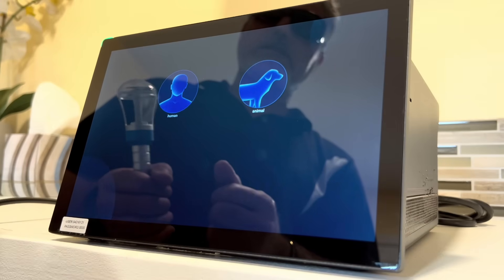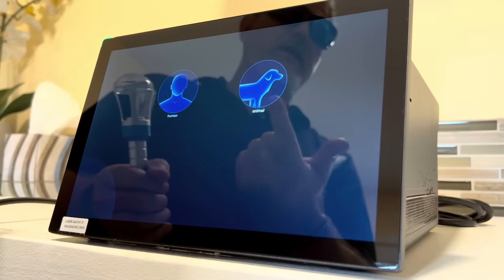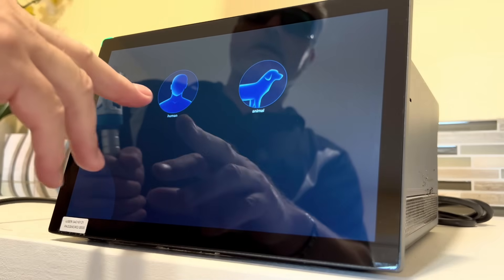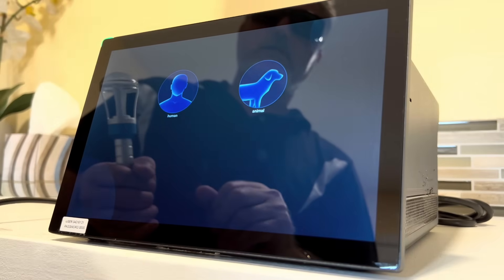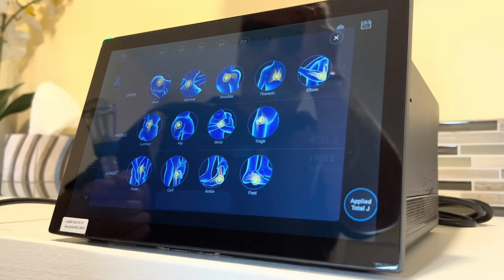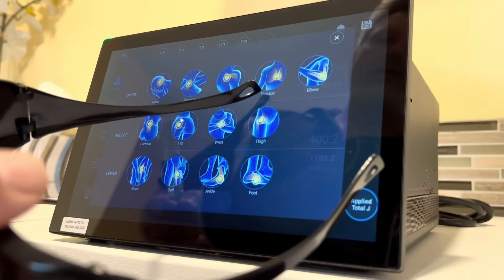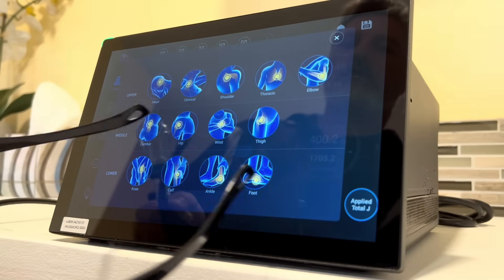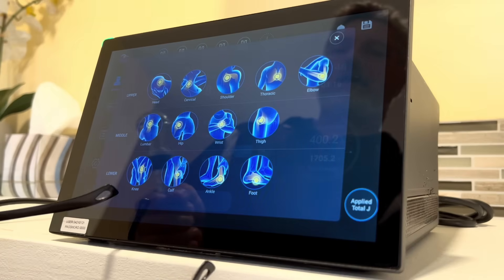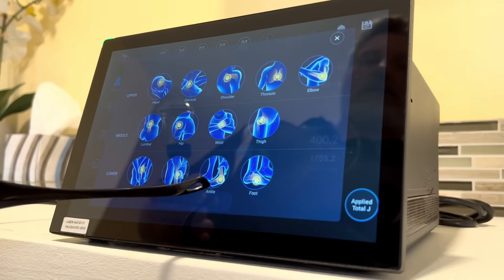Now we have two choices: human or animal applications. It has preset protocols for both. On the animal side we can do equine, canine, feline, and exotic animals. On the human side, we've got protocols for head, cervical, shoulder, thoracic, elbow, lumbar, hip, wrist, thigh, knee, calf, ankle, and foot.